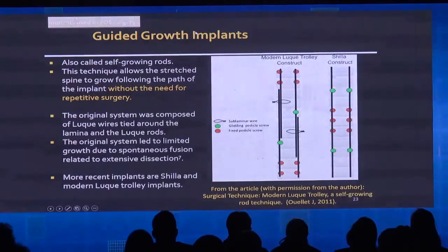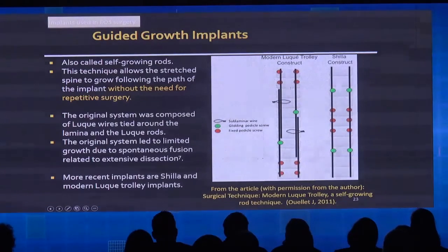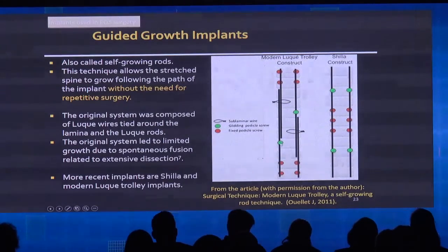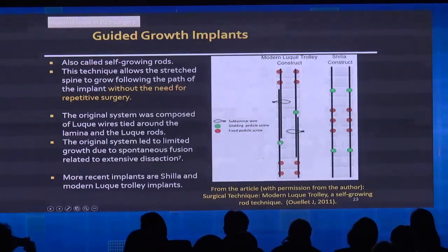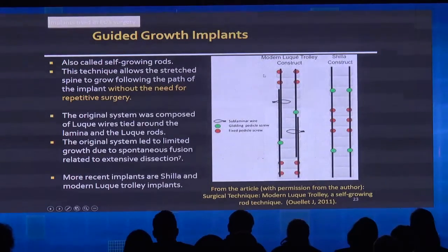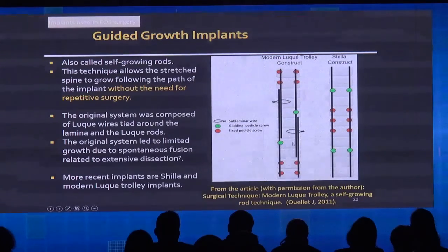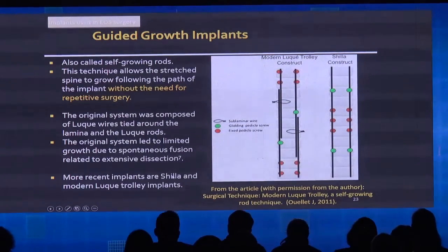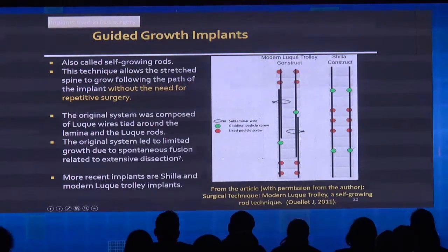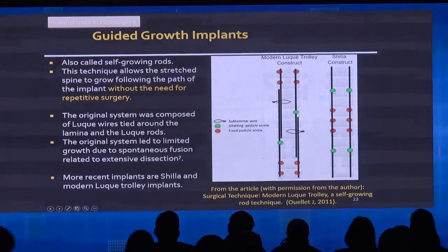Finally, guided growth implants are even more clever, because you have screws which are strongly connected to the rods, the red ones, and you've got other ones which are in fact more like guides, providing the possibility for the rod to slide. So you have two main ways to do that. You can have your anchors at the extremity and it will slide in between with two rods, a little bit like for the growing intramedullary nail, which could be used in osteogenesis imperfecta. Or you can have a piece of strongly connected screws in the center of the device with long rods which would slide through it.